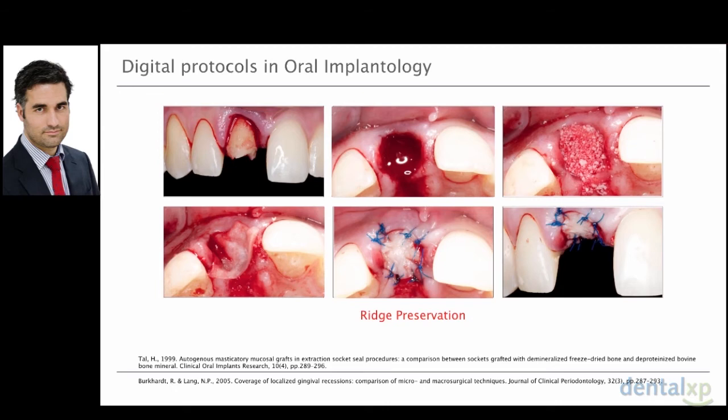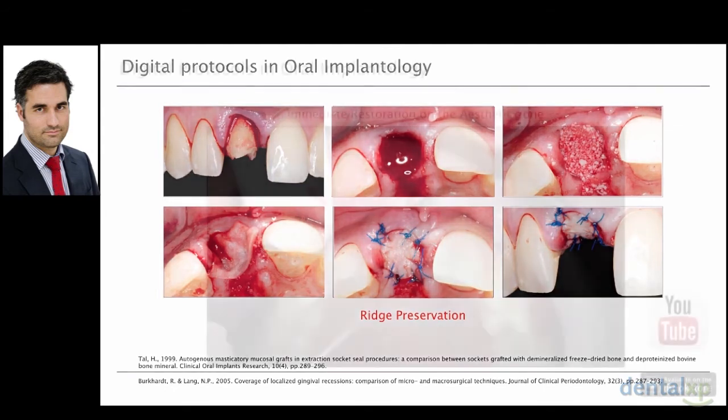If you use small sutures and small needles, you will get a recovery of the blood supply faster than if you use thick sutures and needles. So you should respect that. This is science, so we should always do a microsurgical approach in this kind of technique.